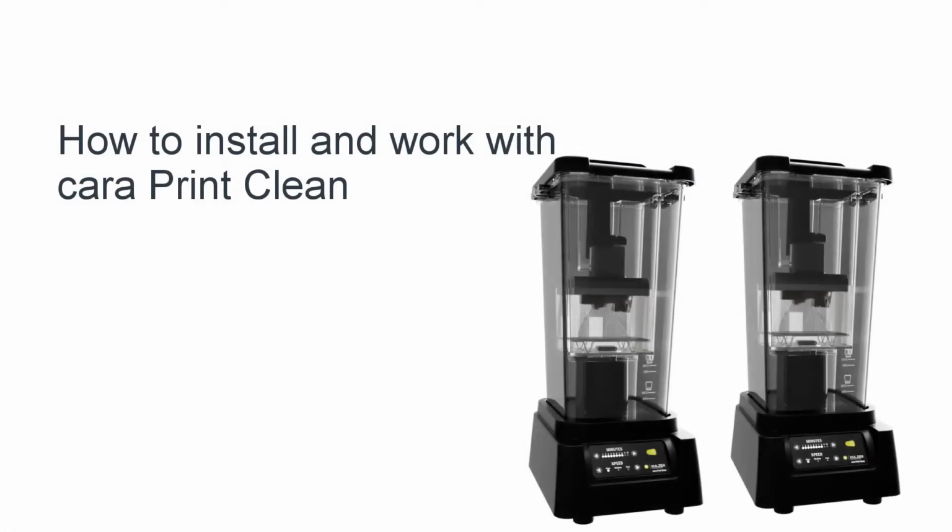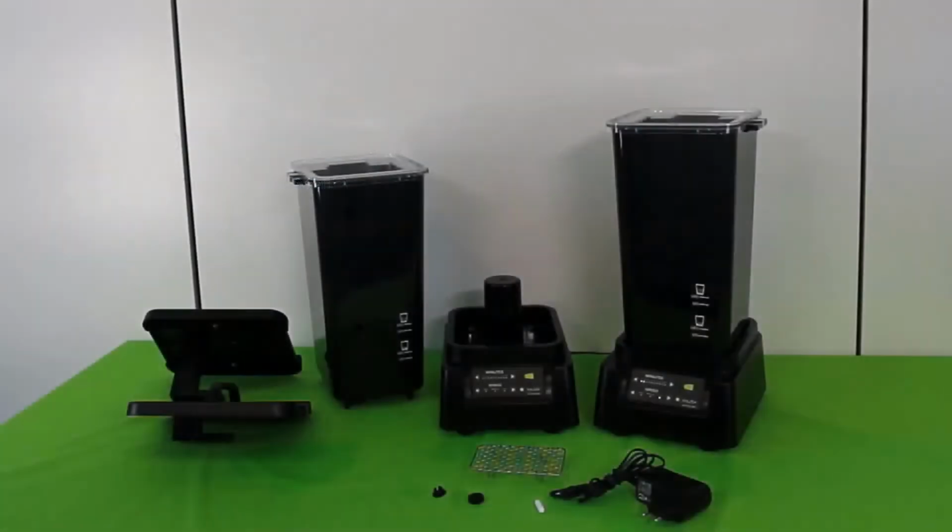This video shows the installation and use of Cara Print Clean. Remove all supplied parts from the shipping carton.